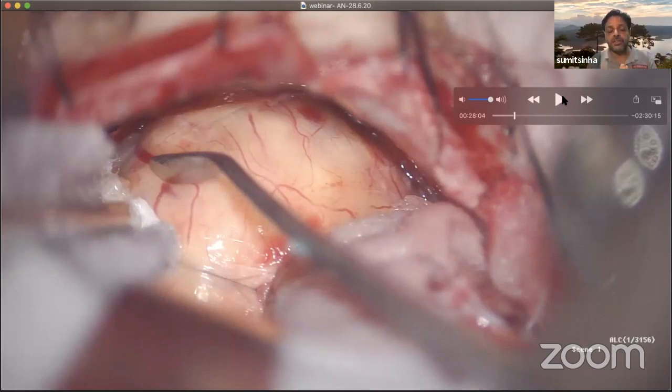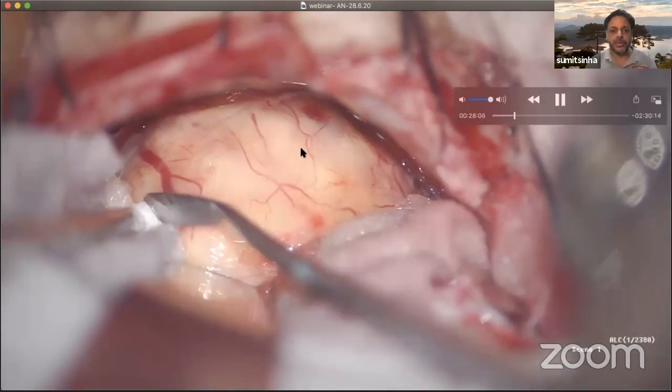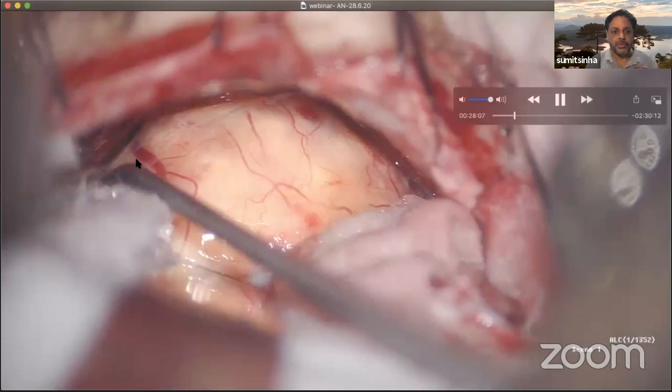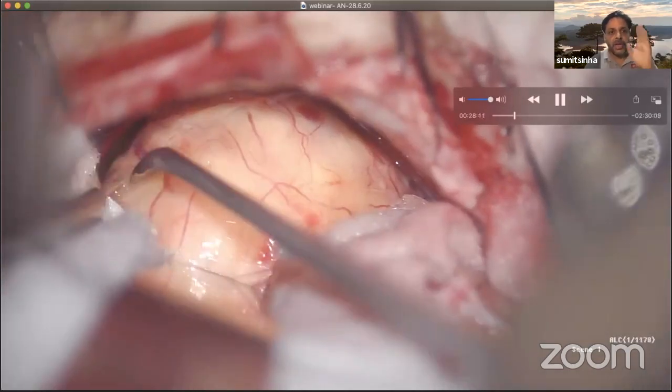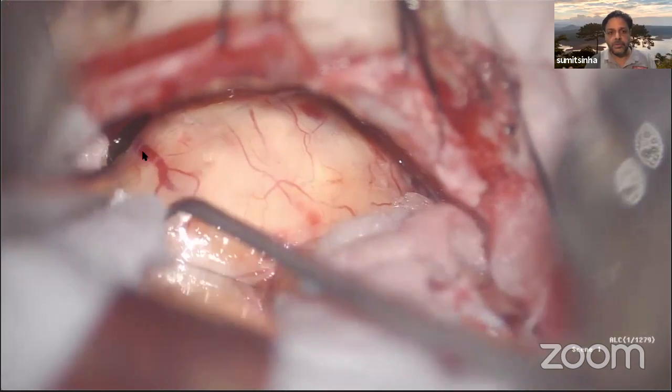Once you identify these structures, you have to preserve them, because there is no arachnoid capsule on the facial nerve, as you will shortly see in this video when I identify the facial nerve. This is a very important valid point I'm making right now. So always remember, all these structures are outside this arachnoid capsule except the meatal structures.